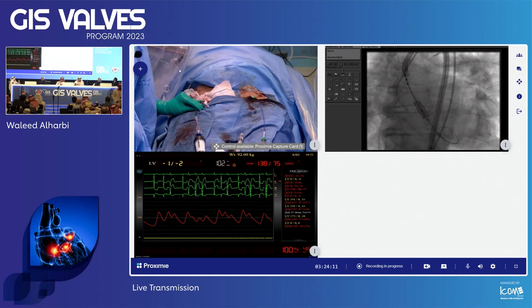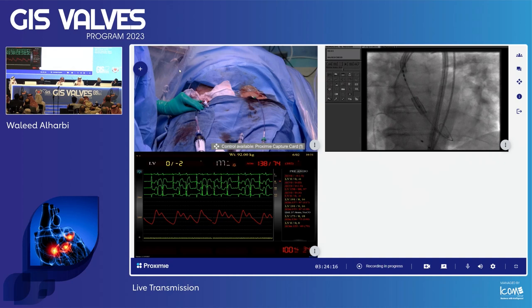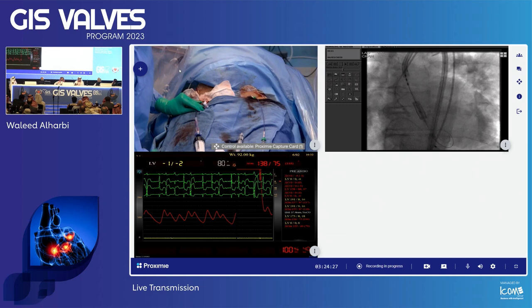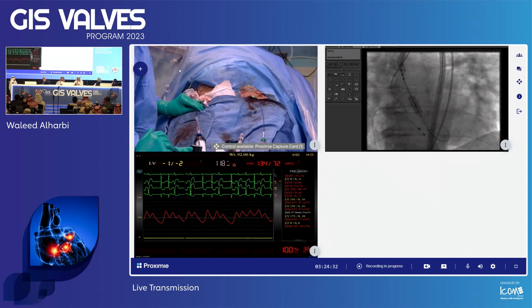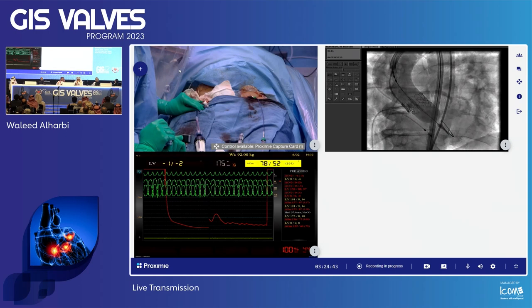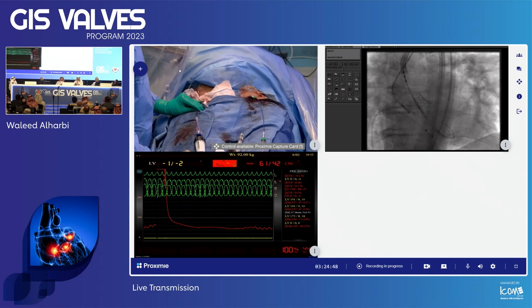She has a very small LV, so we are at the apex now. Test — okay, that's good. We're going to go ahead with this level. Ready — test pacemaker on. You might release some flexion on the wire. One, two, three, four — okay.